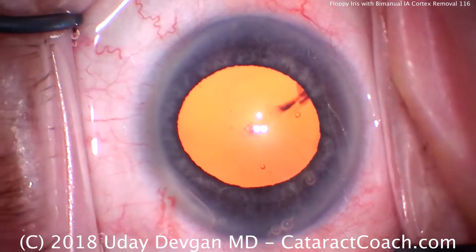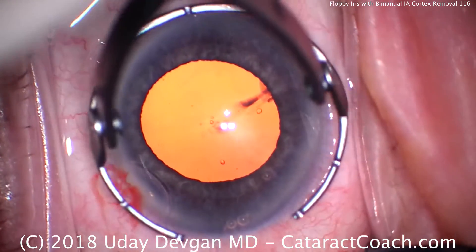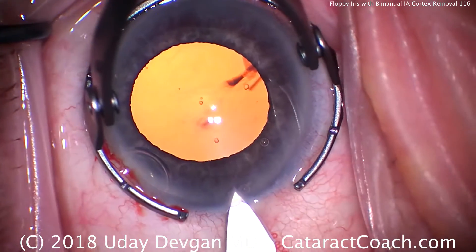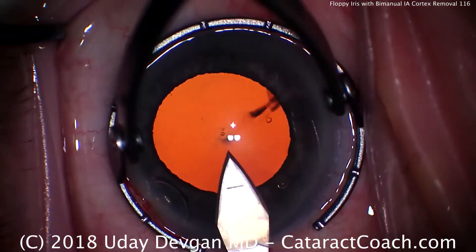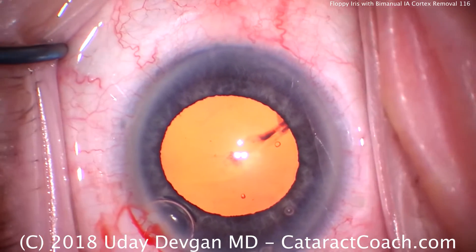There's big dilation there — that looks great, but that's the viscomydriasis, meaning the viscoelastic is holding the pupil open. We'll create our main incision here, single plane using the keratome. And remember, we're going to create that capsulorhexis on the large side.